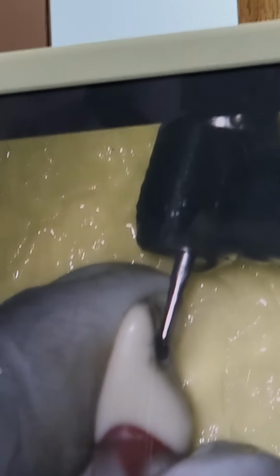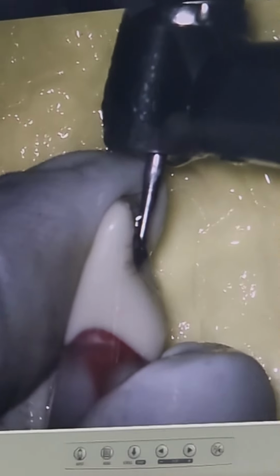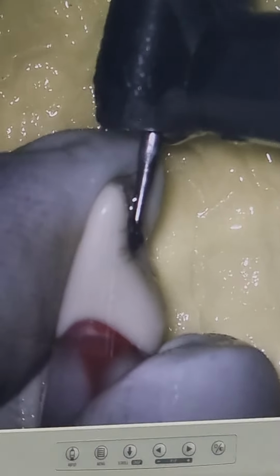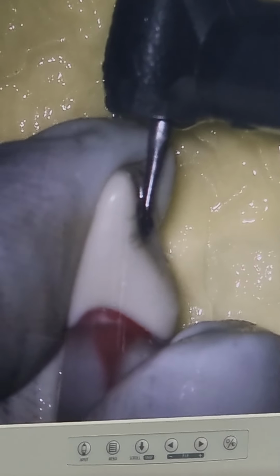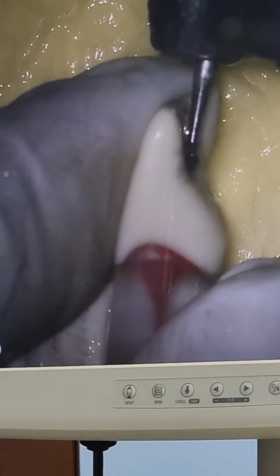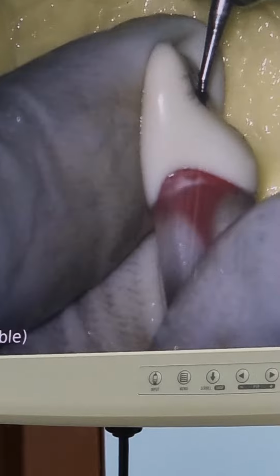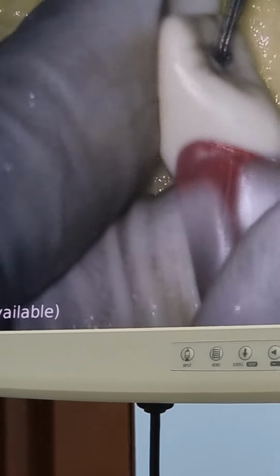Why? Because we don't want to cut the incisal edge. If you keep it straight, the shank of the bur will rub against the incisal edge and may cut it. This is a round bur, but when you use a tapered fissure bur or endo bur, you may cut the incisal edge. So keep it slightly tilted towards the lingual.